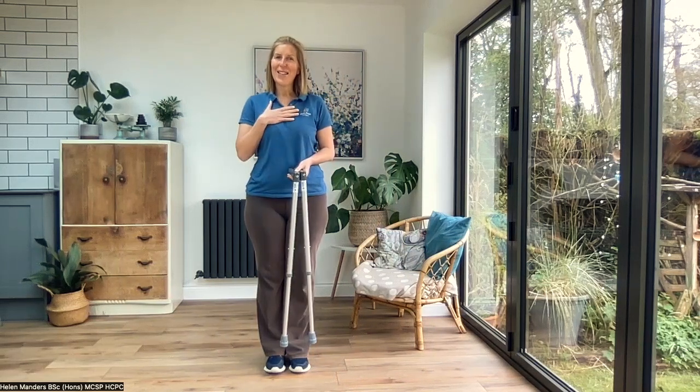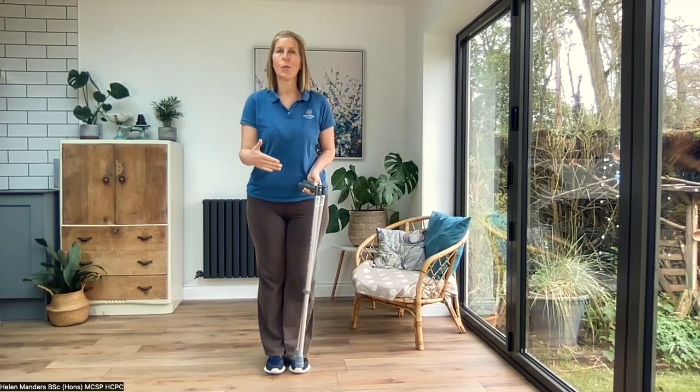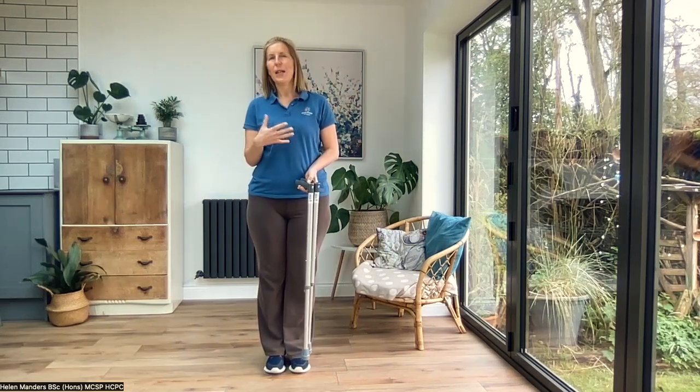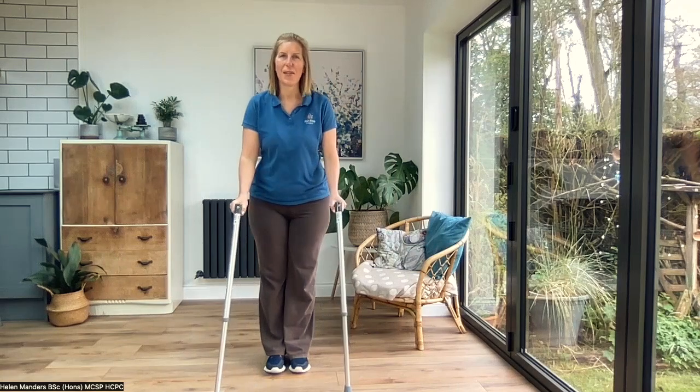In my experience over the years, some people just will not be able to coordinate that last one. If that's you, give it a go. If you can't do it, just stick with moving the two sticks together.